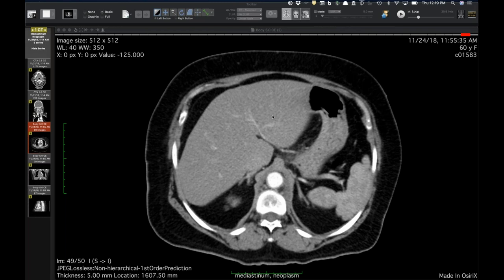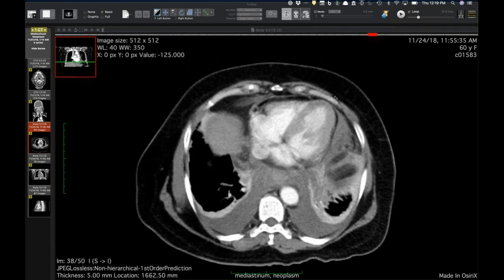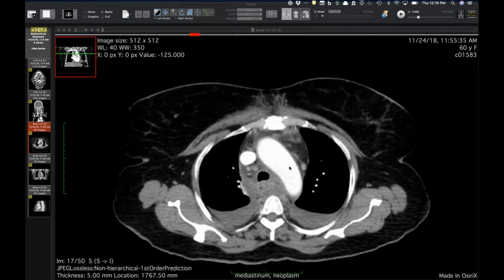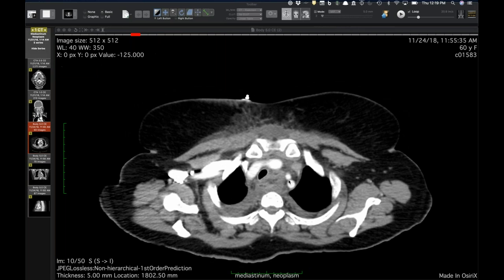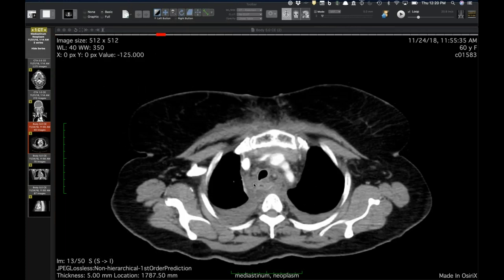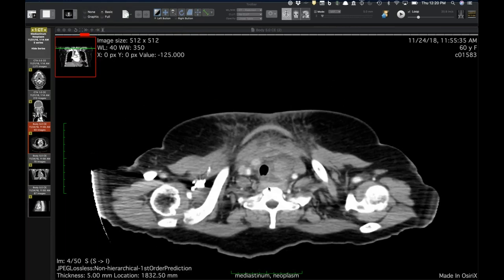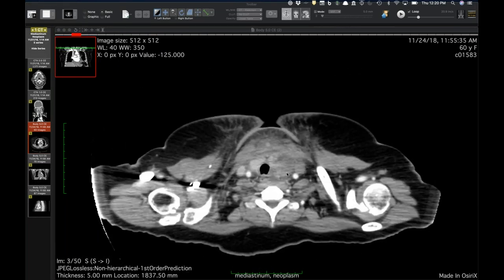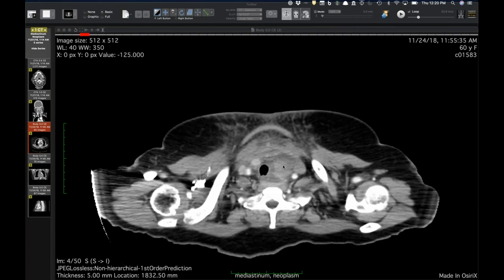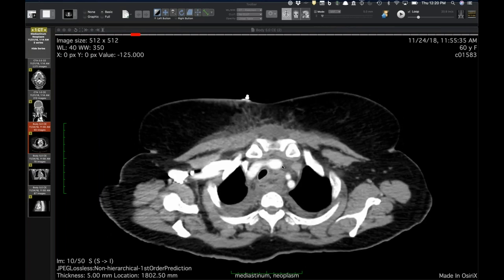Travis: I have a few cases to show. This was an outside study - they were admitted and I reviewed this CT. You see small effusions, a lot of inflammatory stranding in the mediastinum, and in the subcutaneous tissues anterior to the sternum, there are small nodes in the mediastinum as well. Then there's this weird soft tissue mass either arising from or involving the left thyroid gland - or maybe even a hematoma because some of this is heterogeneous in attenuation. I was worried about bleeding into the mediastinum or mediastinitis, and you can see there's mass effect on the trachea.